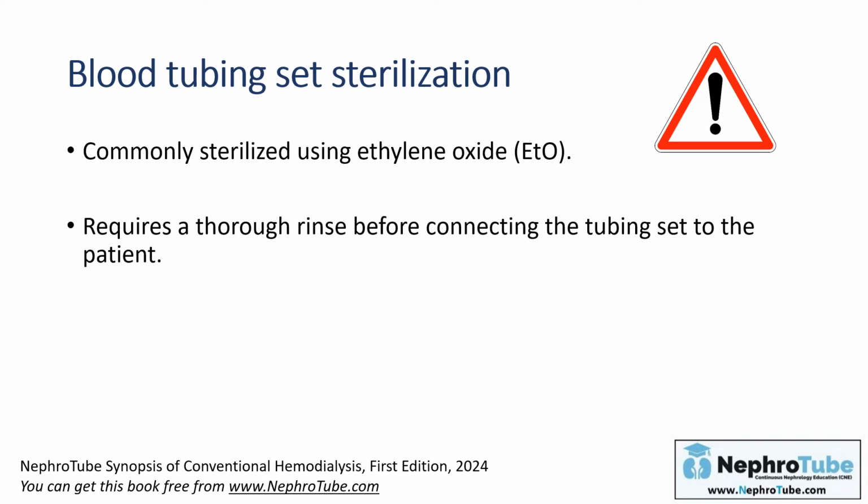So, a thorough rinse before connecting the tubes to the patient must be done to avoid the allergic reactions that may be precipitated by the ethylene oxide if it entered the patient's blood.